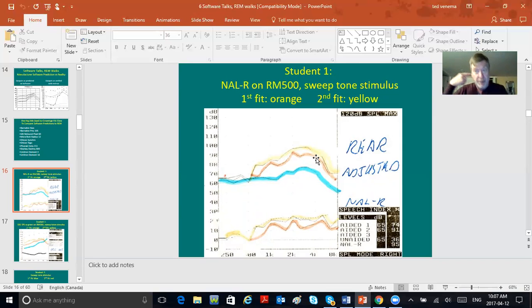So now, probe tube in the ear, and hearing aid in, sit the person 18 inches in front of the speaker, do the real ear, and here's what your aided output, or your aided gain is, REAR, and looky, REAR, the pink, minus REUR, the blue, gives you real ear insertion gain. And look at how short that is from target.